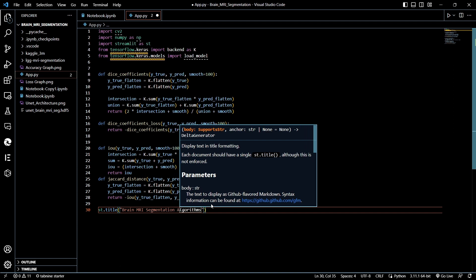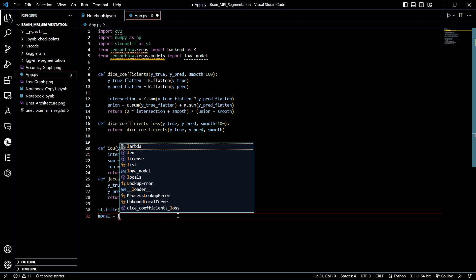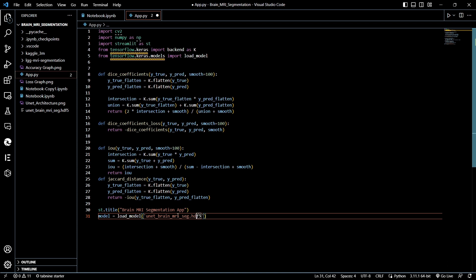Now we are going to load our model that we have previously saved as the UNet Brain MRI Segmentation HDF5 file. For that we are going to use load_model(), which we have imported from tensorflow.keras.models, passing in 'unet_brain_mri_seg.hdf5'.